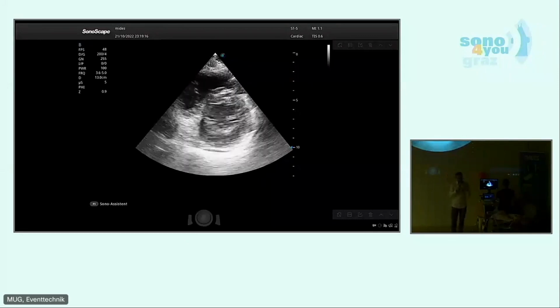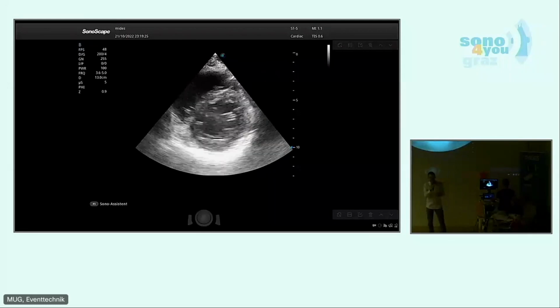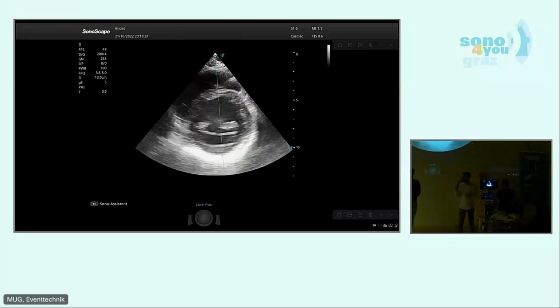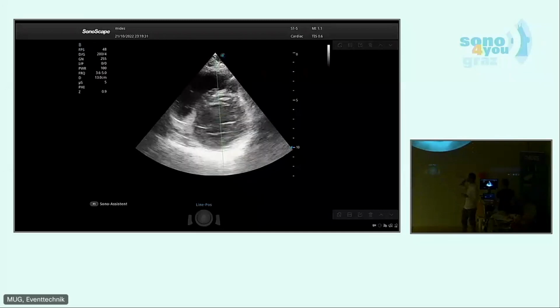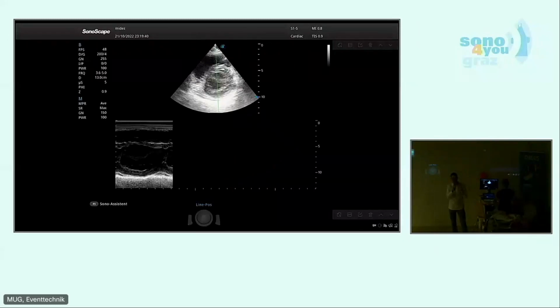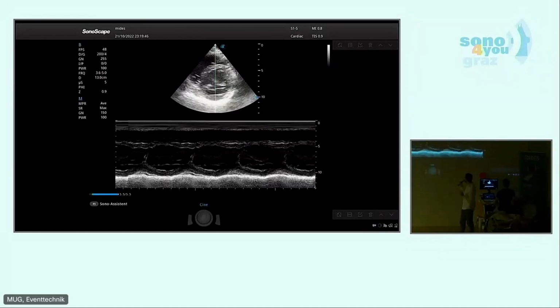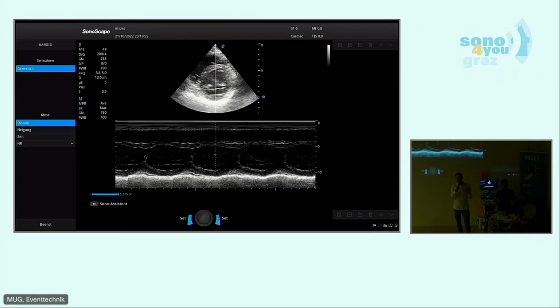If we want to quantify the movement and the contraction, it's very useful to use the M mode. For the M mode, you can see we put an axis into the heart, into our cut. Now try to imagine what it looks like to have just the picture points of this axis projected over time. You will see that now. And as we freeze, you can see this is a great image to make measurements and to quantify precisely the movements of our tissues.